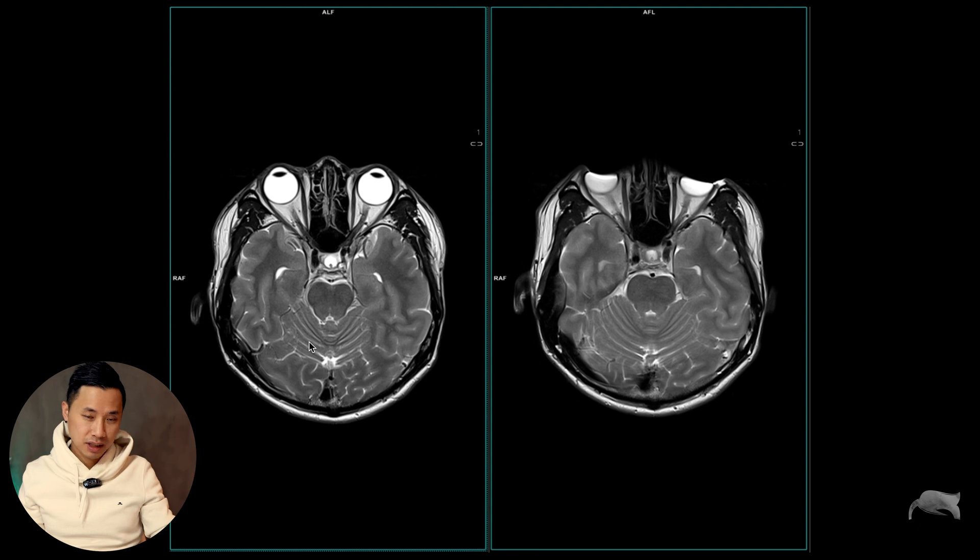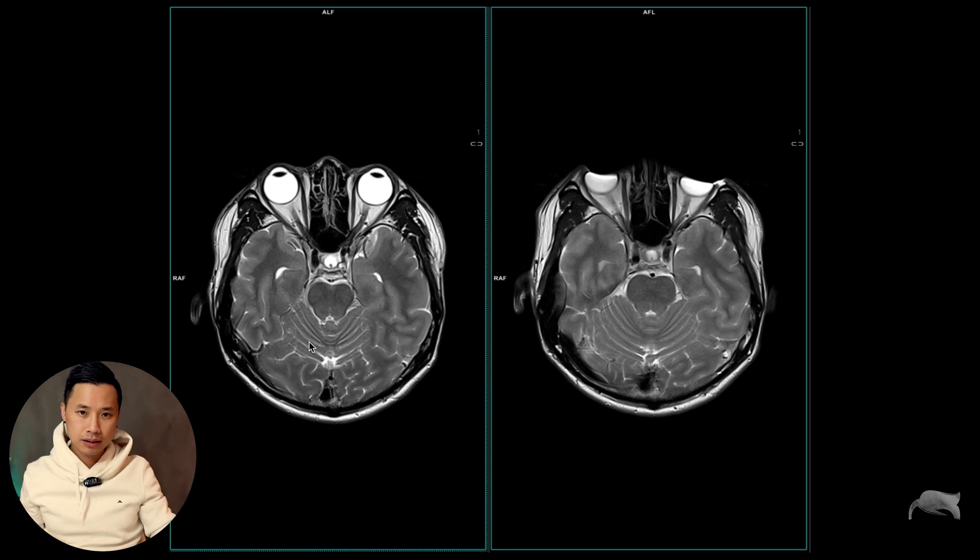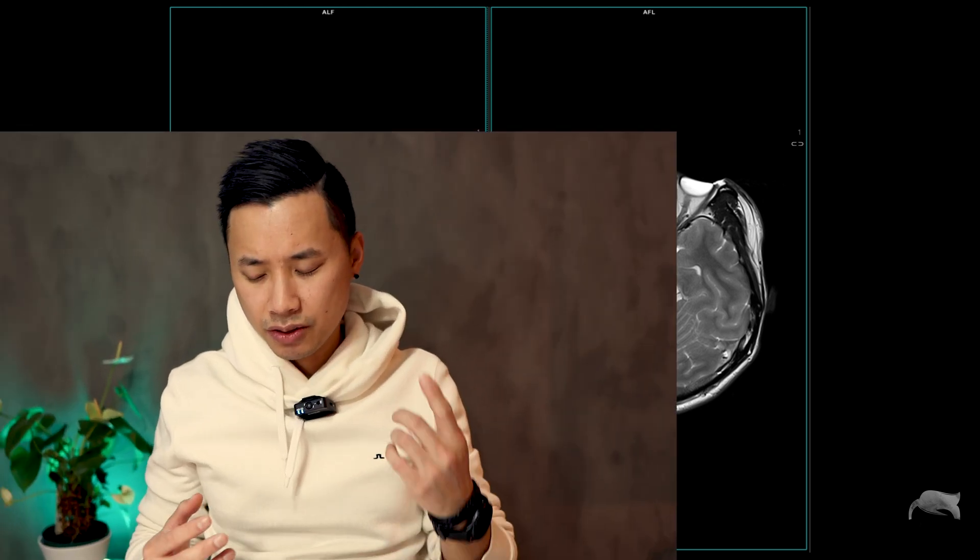Do you believe me if I say there's a face mask on both? The test was done without any modification of the face mask — I did not do anything to it before scanning, just took it right from the box, applied it, and scanned. This is actually an image of my own brain, my own eyes right there — my colleague did the scanning. We can clearly see the artifact on one side and no artifact on the other.